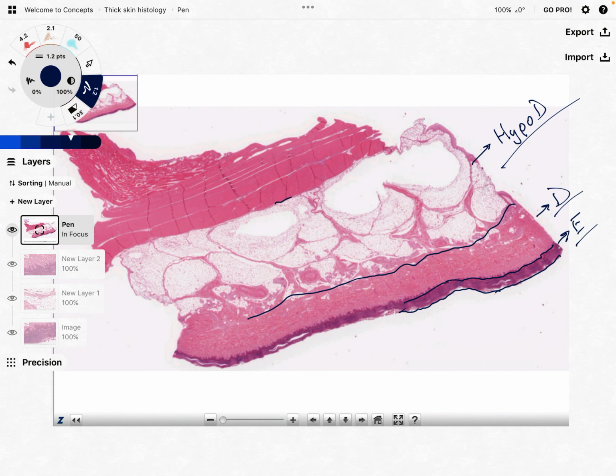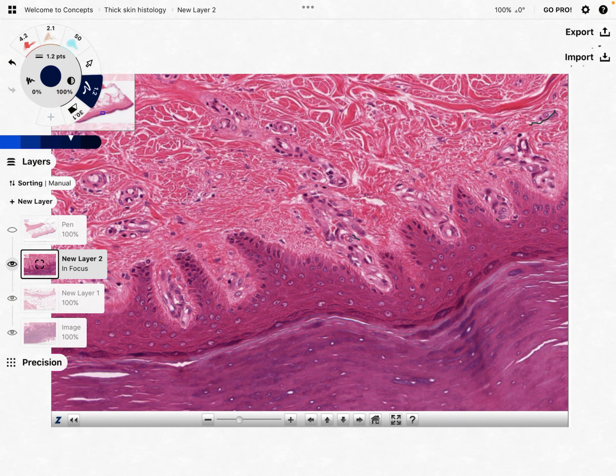They're the same thing. Last thing we can see here is that we actually have some skeletal muscle as well, which is pretty cool. We're not going to obviously focus on that today. I will do a skeletal muscle video. I would like to actually do a comparison of skeletal muscle, smooth muscle, and cardiac muscle, because that also is very helpful, and it's often something you might see on a lab practical. So that'll be for another time. Here we're going to focus particularly on the epidermis, but I want to show these other layers first.